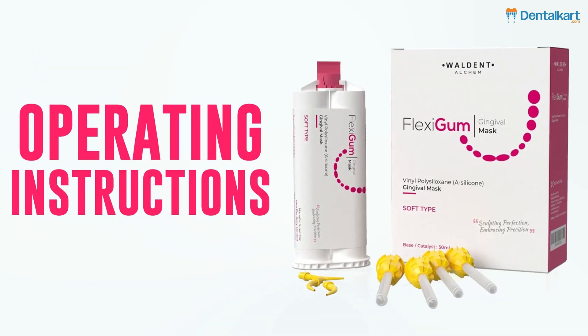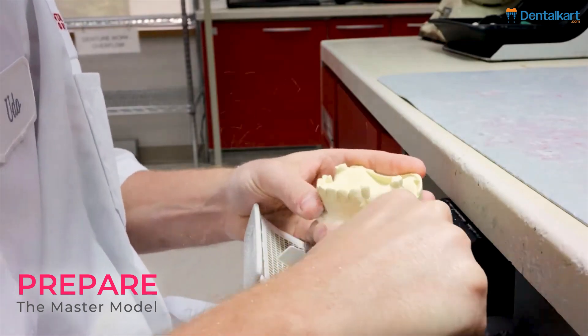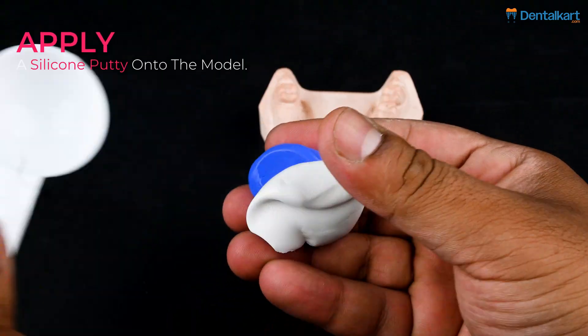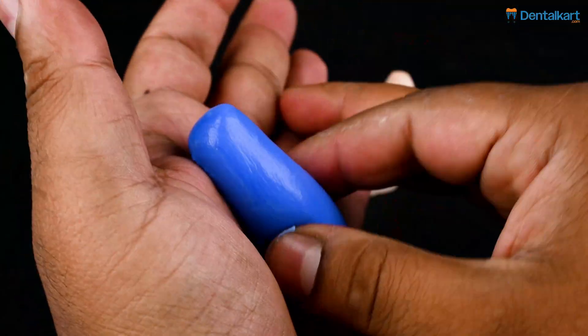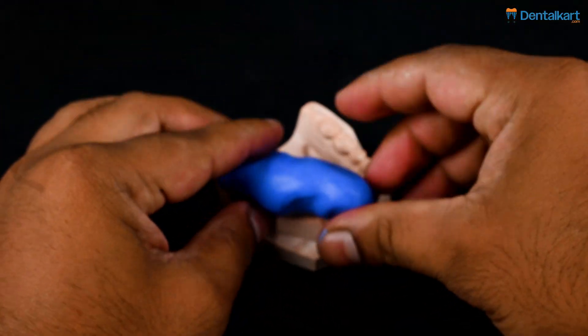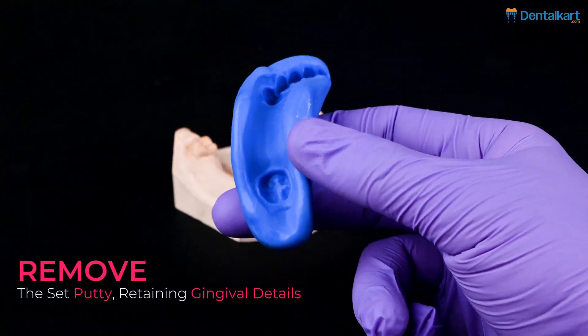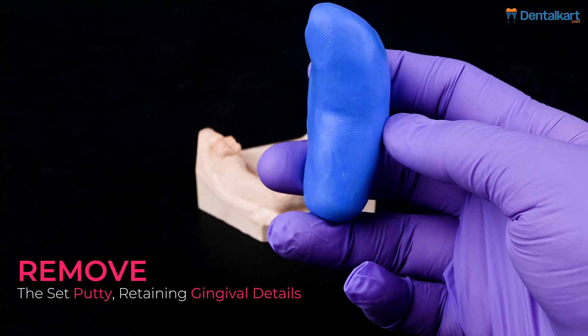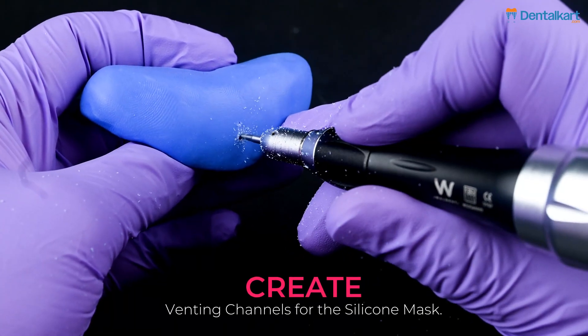Let's see the operating instructions for the indirect gingival mask fabrication technique. First, prepare the master model. Apply a silicone putty onto the model. Remove the set putty retaining gingival details. Selectively remove gypsum from the gingiva in the master model. Create venting channels for the silicone mask.